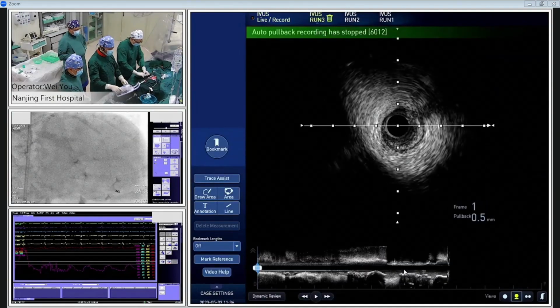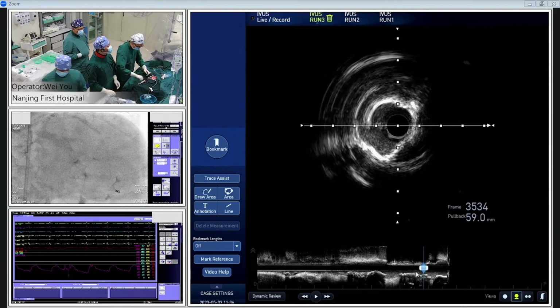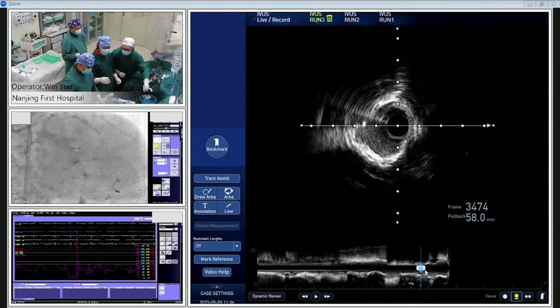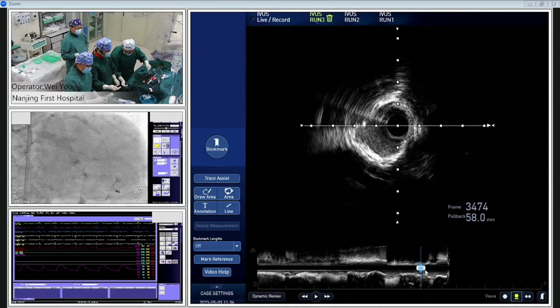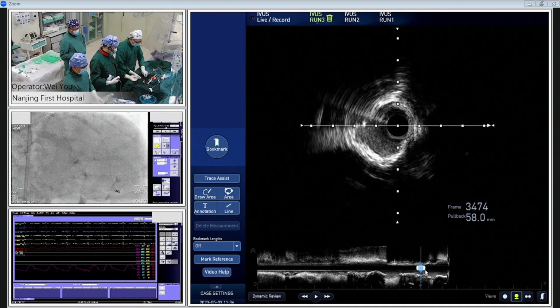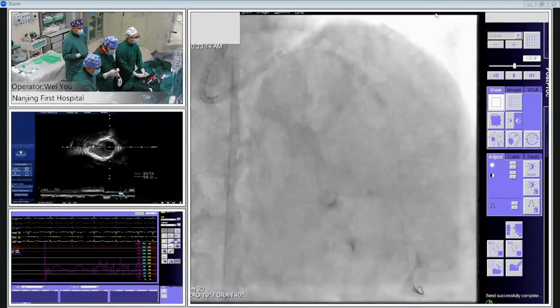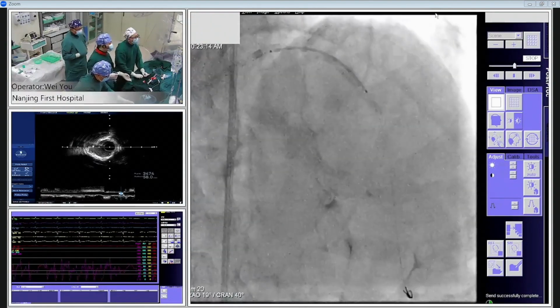Give me the first stent, 2.5. After IVUS imaging, we confirm the result. So chief, do we need a big size NC balloon or modified balloon to modify the proximal segment? Yeah, I think so. We will do the post dilation: for distal we'll use 2.5, for middle we will use 3.0, for proximal, I think maybe 3.5 is suitable, according to the IVUS imaging result. Okay. Please.